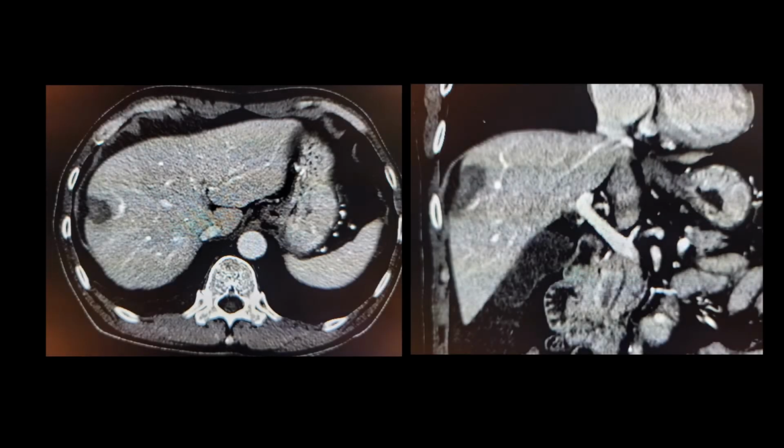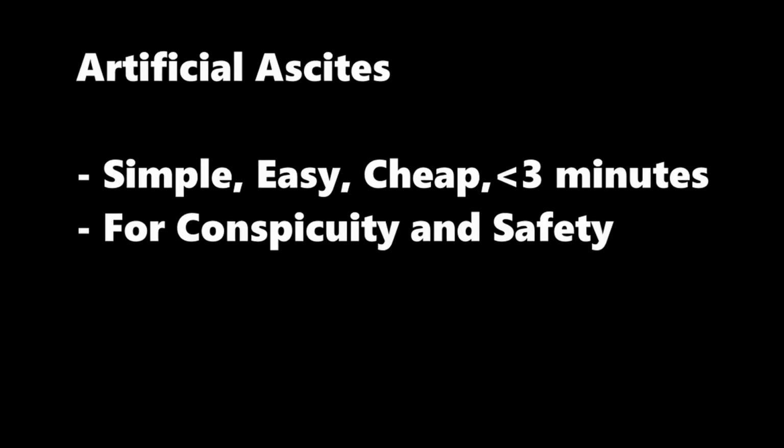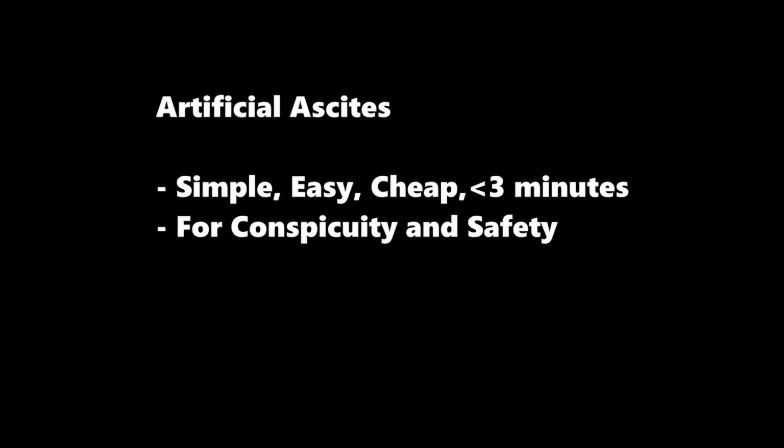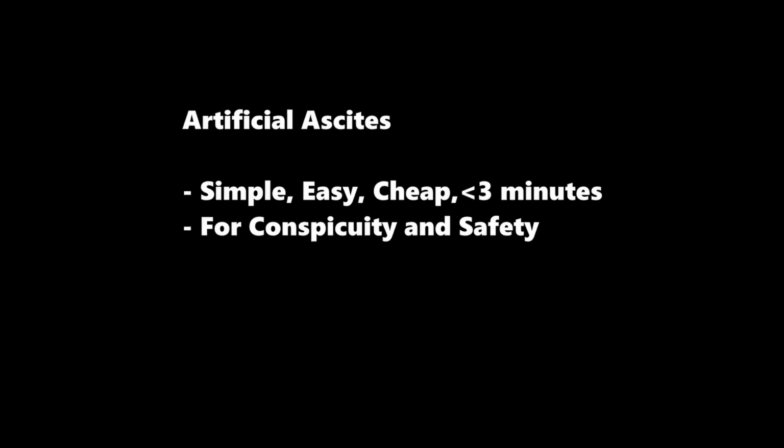So, immediate post-ablation CT, quite optimal and safe ablation. So artificial ascites is a simple, easy and cheap technique, using less than 3 minutes.